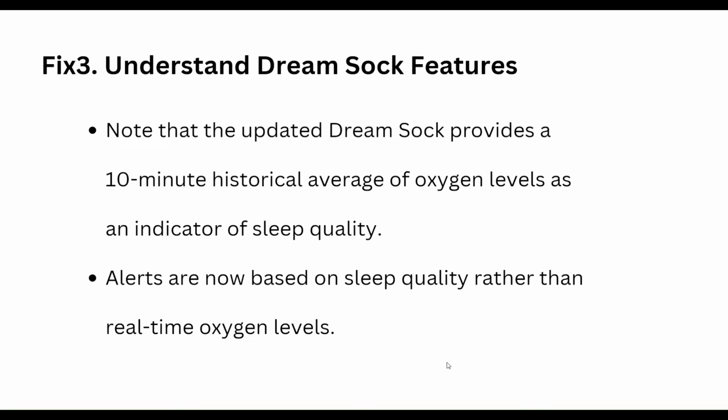So the third step is understand the Dream Sock feature. Note that the updated Dream Sock provides a 10-minute historical average of oxygen level as an indicator of sleep quality. Alerts are now based on the sleep quality rather than real-time oxygen level.